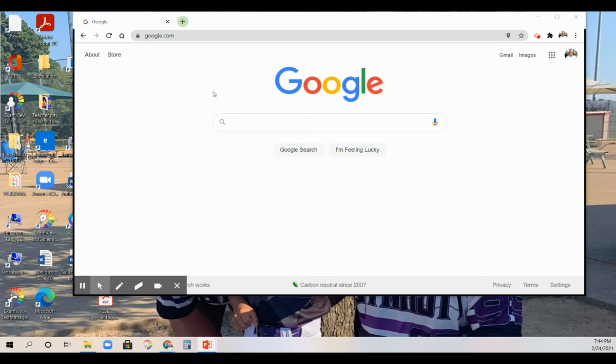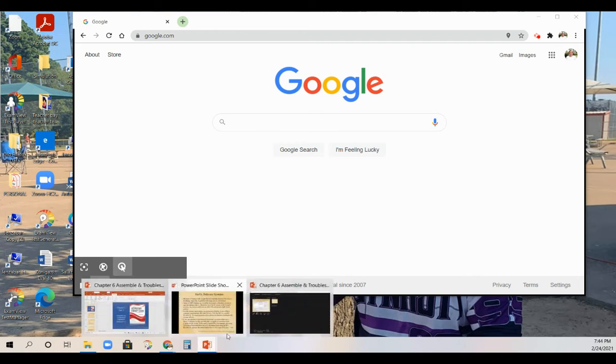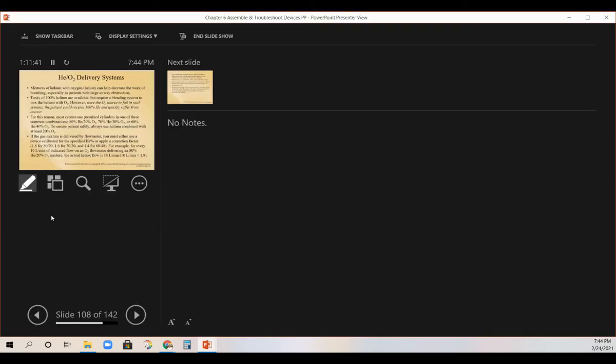So your correction factors are going to be right here. Okay? All right, 1.8 for 80-20, 1.6 for 70-30, and 1.4 for 60-40, okay?